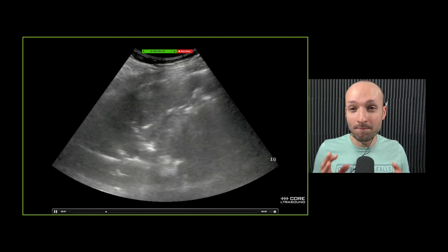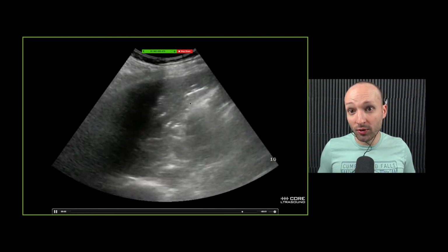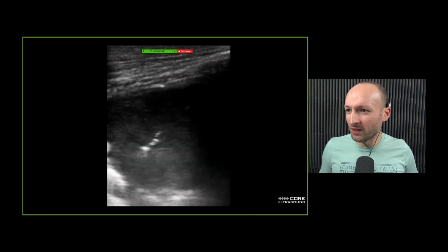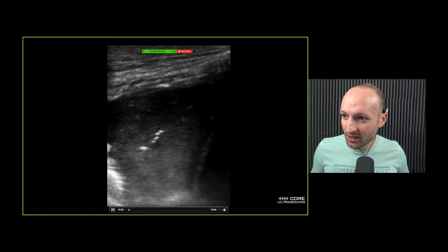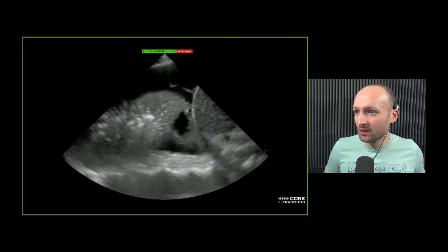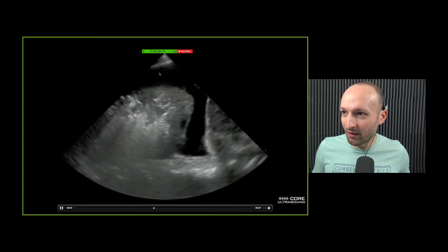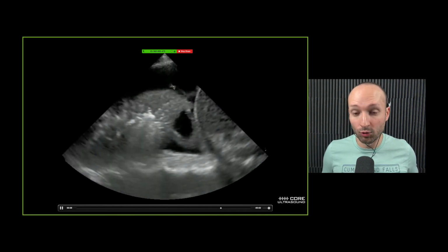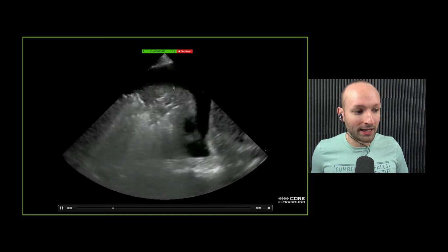So if you see pneumonia worms, think a bacterial pneumonia, because that's where they've most commonly been described. You can also zoom in on this if you want to. Here is a linear transducer, big consolidation here, and there are the little air bronchograms right there. And then here is just a disgusting lung. So we have a big pneumonia in that lung. We have a big pleural effusion and a bunch of that wispy stuff in there. This is a pneumonia with a parapneumonic effusion, probably an empyema.